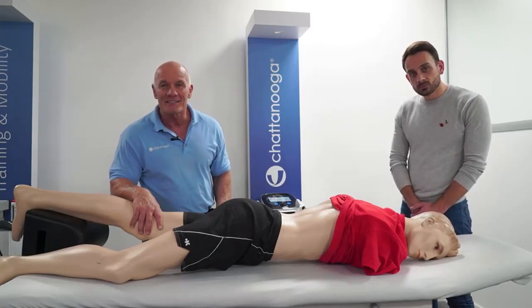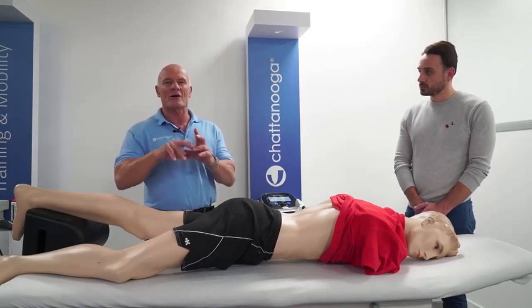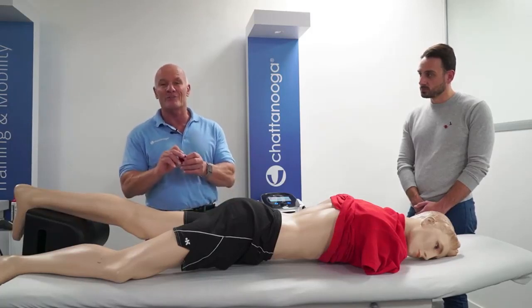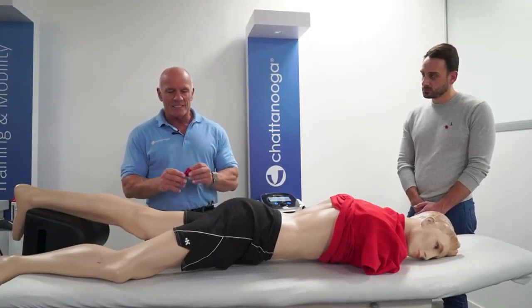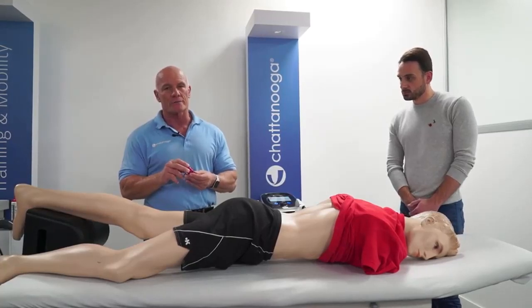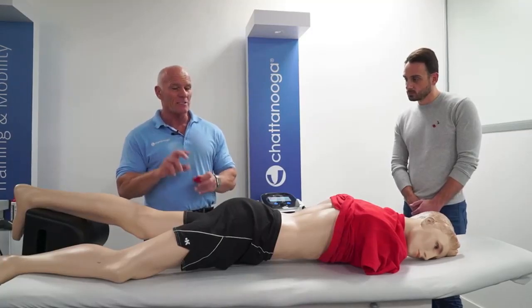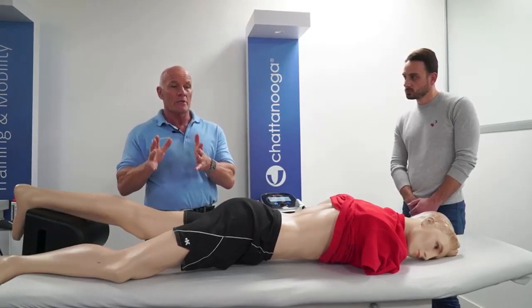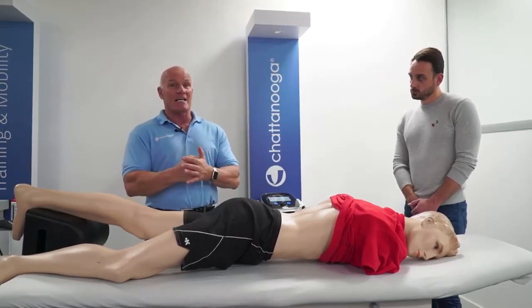Okay, so thank you. I've got a question asking about how long does the transmitter live, the life of the transmitter. The answer to that question is roughly, the manufacturers will tell you to change it after 1 million shocks. I've known transmitters lasting 10 million shocks. And that's why I showed you the good, the bad and the ugly. Because worst case scenario, you're hitting it 21 times per second at 5 bar for 6,000 shocks on every patient. That doesn't happen. It doesn't work like that. Okay?